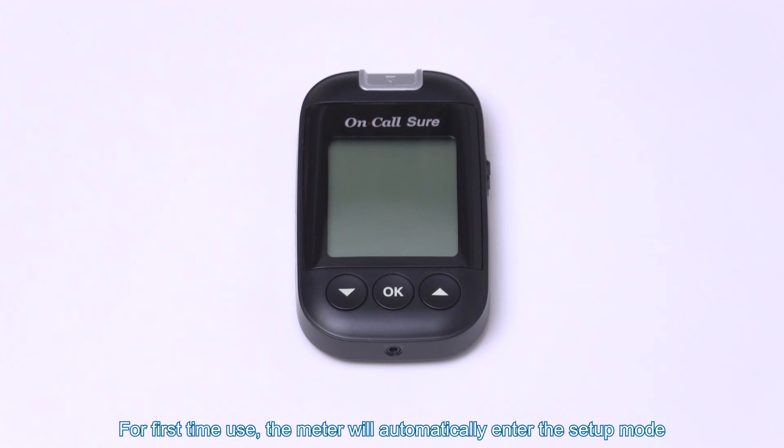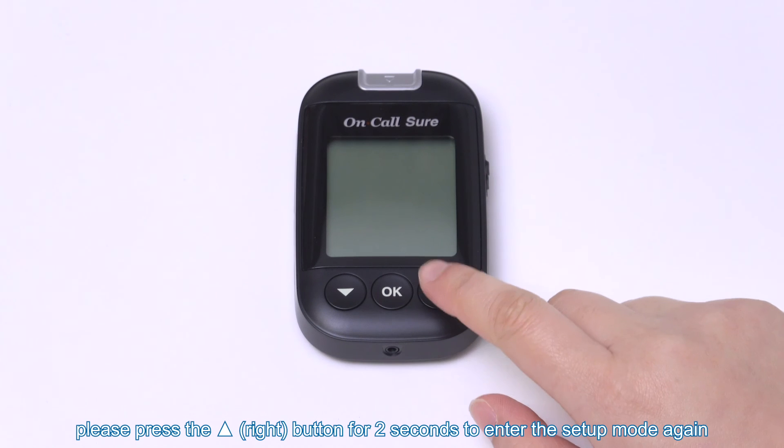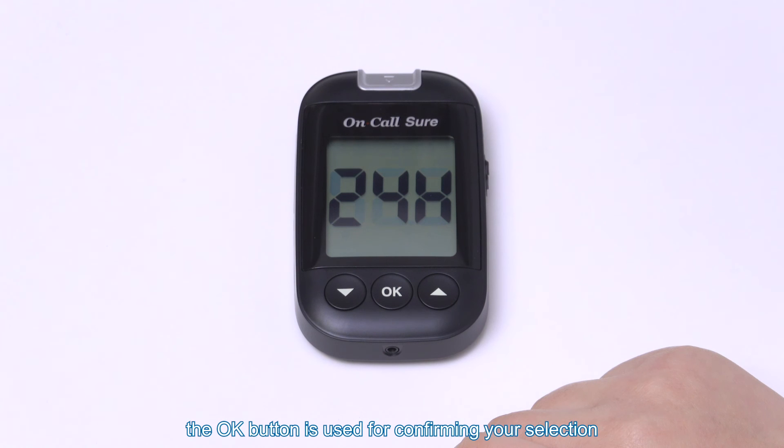Settings. For first time use, the meter will automatically enter the setup mode. To set up again, press the right button for 2 seconds to enter the setup mode. Left and right buttons are used for adjusting, and the OK button is used for confirming your selection.